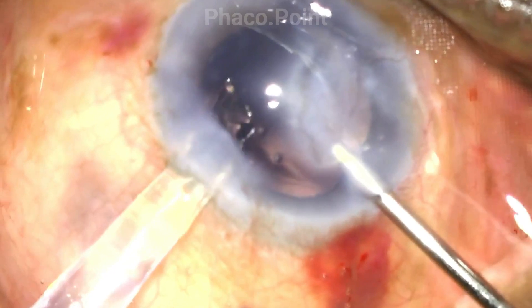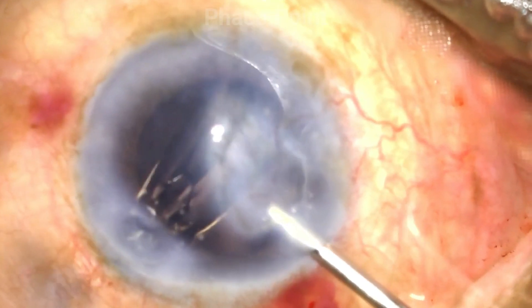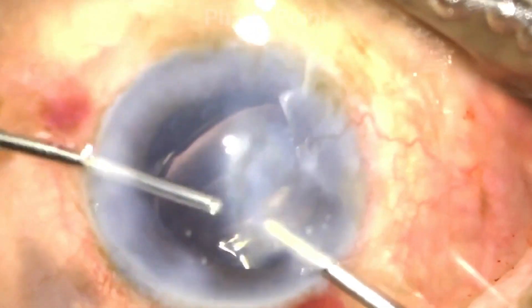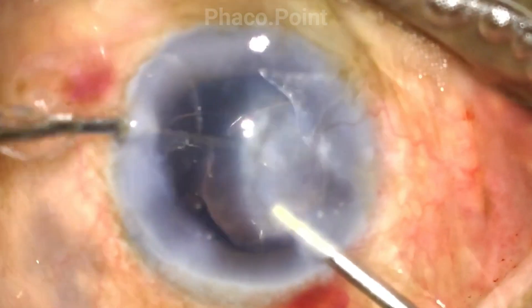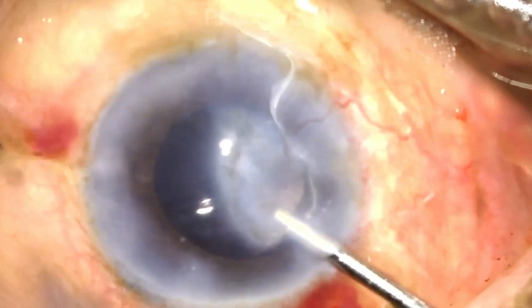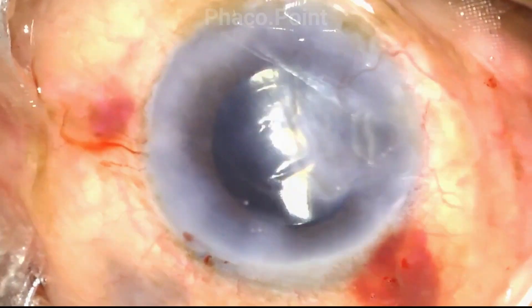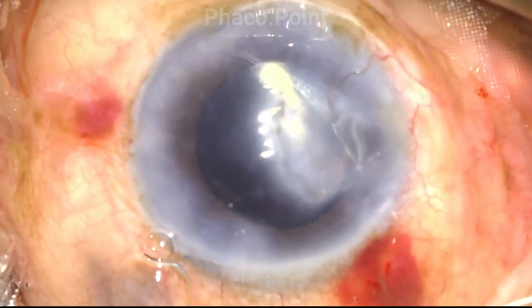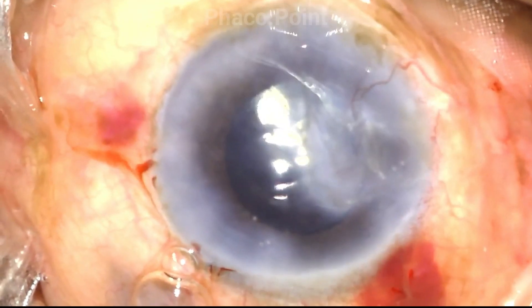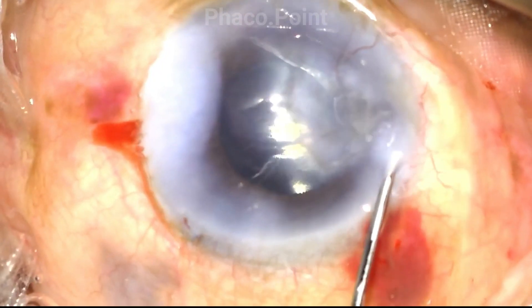Upon completion of the irrigation aspiration, I perform hydro-implantation of the monofocal IOL in the bag. We need to ensure the entire IOL is within the capsular bag, as limited visibility due to the corneal opacity might make it difficult to see where the leading haptic is going. By ensuring the leading haptic has gone into the bag first, then implanting the rest of the optic and trailing haptic, it is almost certain to remain within the capsular bag.